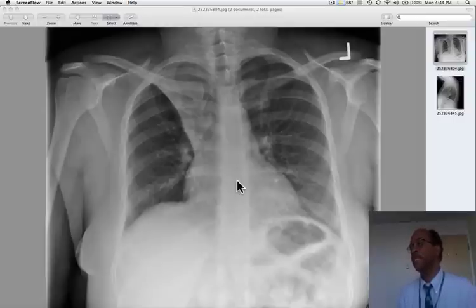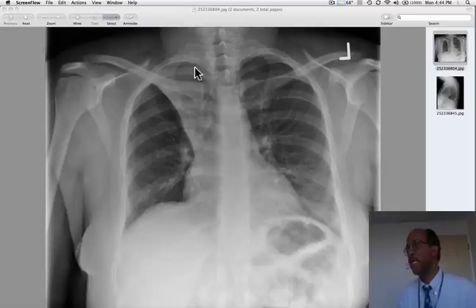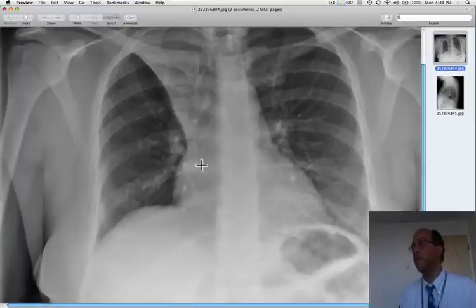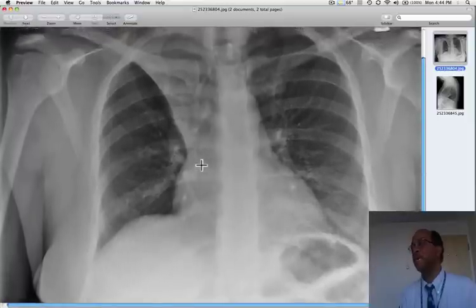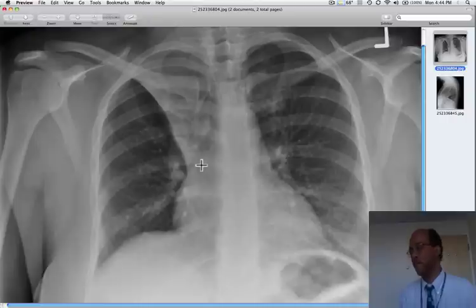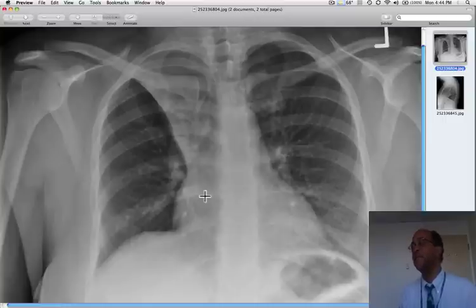First we can appreciate that there's a triangular opacity in the right upper hemithorax. Sometimes it's useful to say hemithorax rather than lung or pleura — it allows us some time to arrive at a conclusion. So there's a triangular opacity here, and whenever we see that, we want to think about right upper lobe collapse.